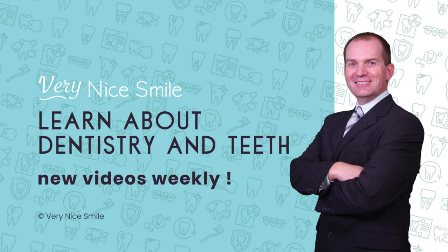Hi dental fans, I'm Dr. Rich, teaching you about dentistry and teeth so that you can have a very nice smile. In this video I want to show you a close-up look at a set of upper and lower immediate overdentures.